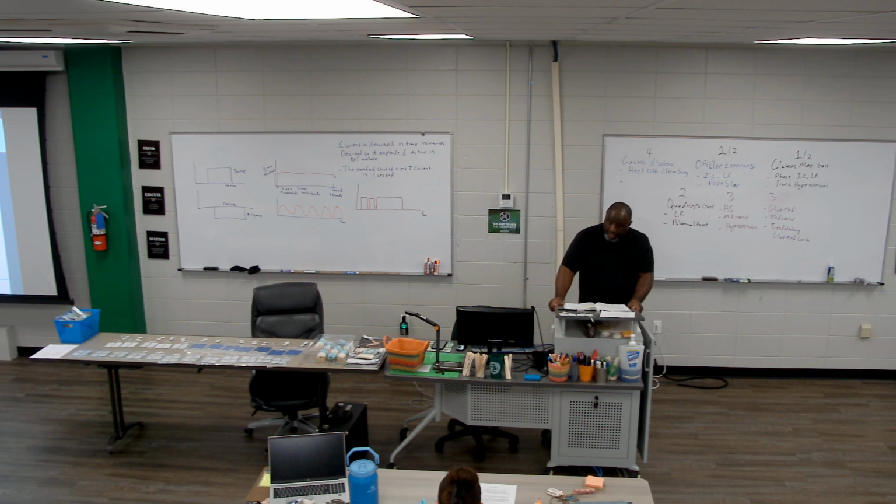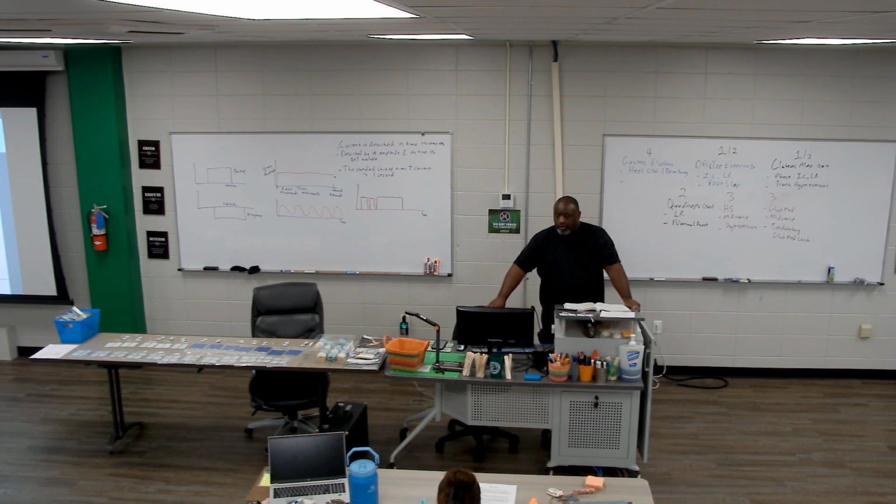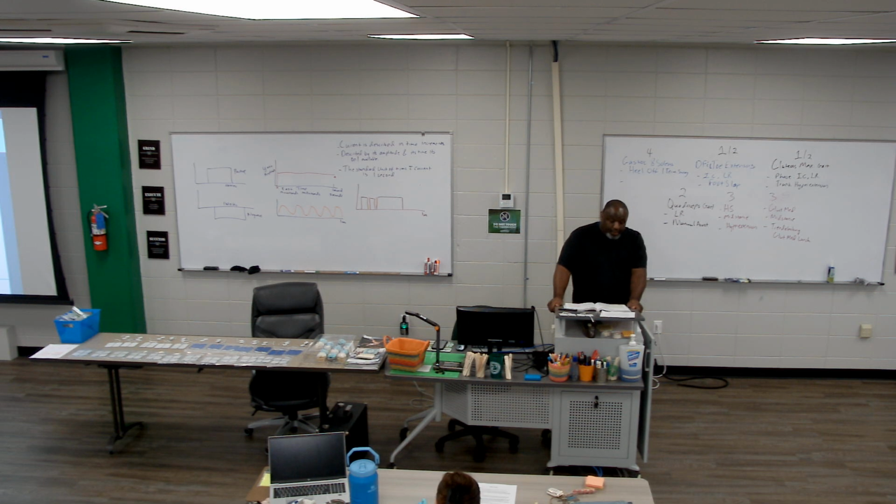Peak amplitude, next paragraph, is associated with depth of current penetration. So the highest levels of amplitude can dictate how far in the tissue we're actually feeling the stimulation. Higher amplitudes penetrate deeper into the tissue. So the higher the amplitude, the deeper we will be inside of the actual tissue.